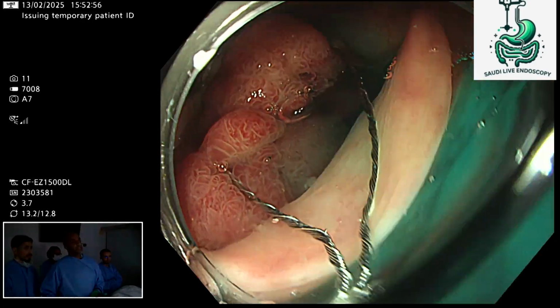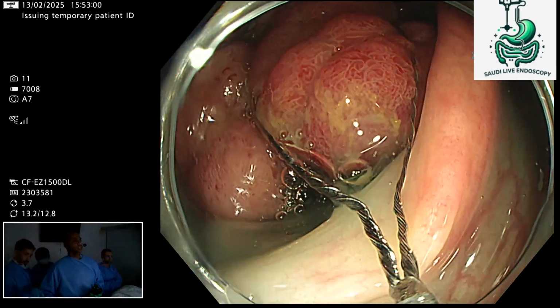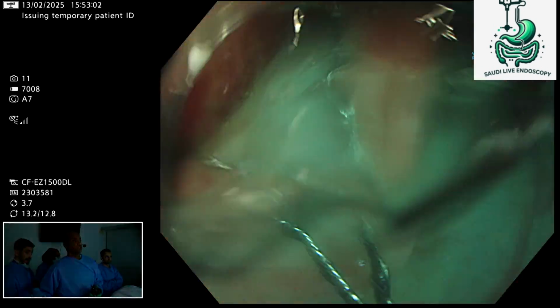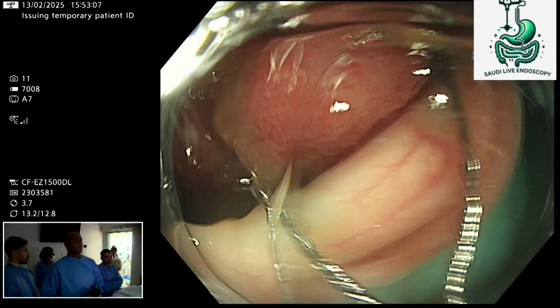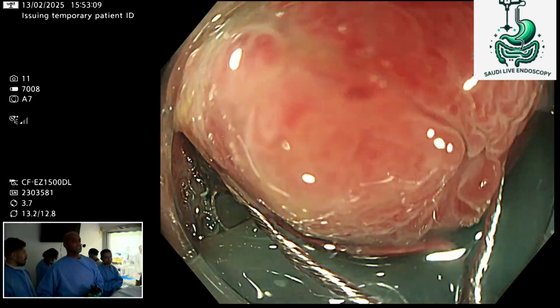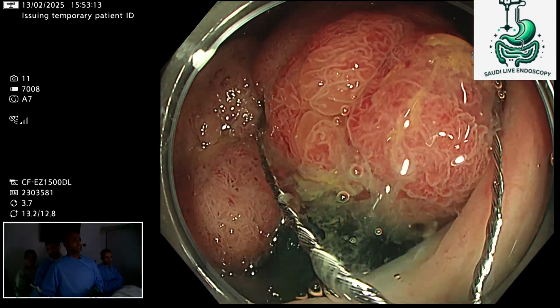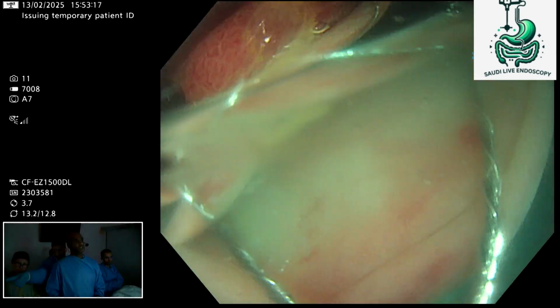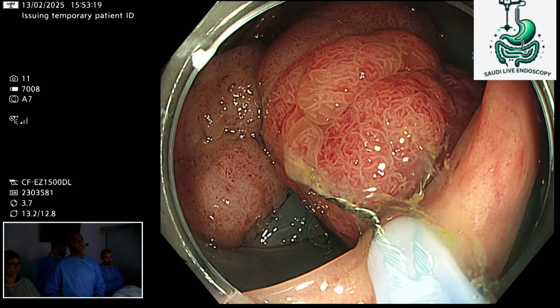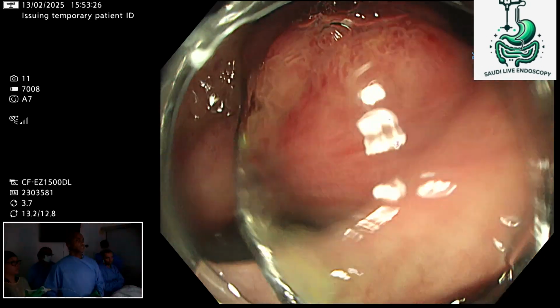Very rarely. In the colon, often if you retroflex, it stabilizes your position. In the duodenum, it's different. I do that. In the colon, you can use it, but to be honest, I've not needed to use it, extremely rare. You can use 10 milligrams of Buscopan, and then you can add another 10 after that. Usually, you don't want to use too much because it can induce tachycardia, especially if you're using epinephrine in your solution. But you can also use glucagon, so either or.